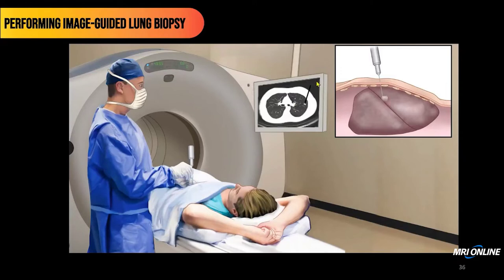The screen the interventionalist is using serves as a guide for performing the biopsy. In this particular case, he sees his needle through the lung into the lesion of interest. A schematic identifies what this looks like anatomically — traversing the skin, the soft tissues, through the intercostal muscles and into the biopsy target. The interventionalist would have reviewed the scan, identified where the fissure was, and noted that the lesion is sitting on top of the fissure. He is ensuring that his throw, his pass, is not crossing the fissure.